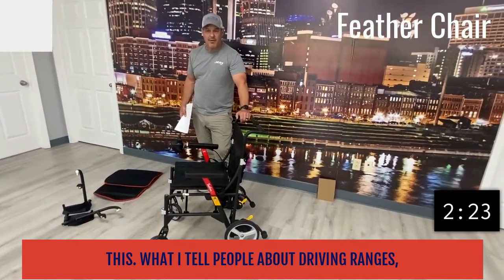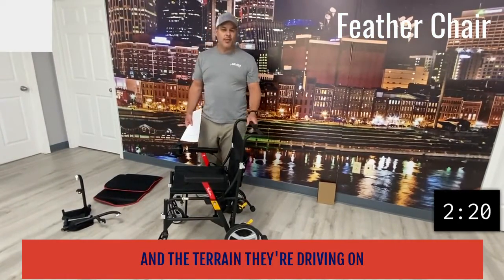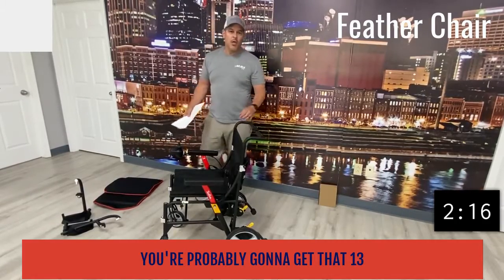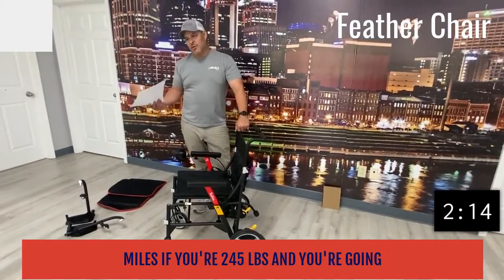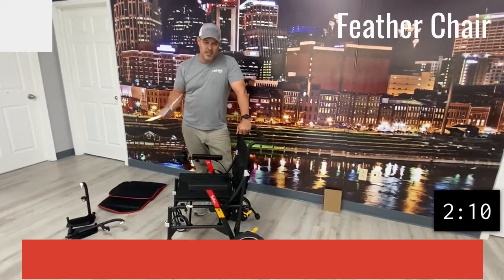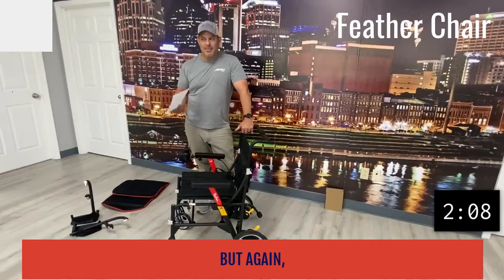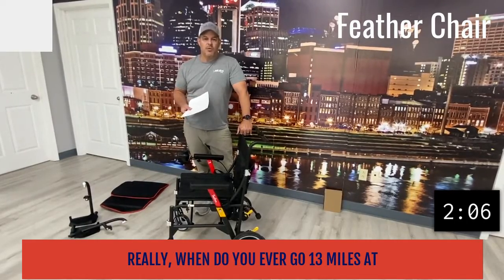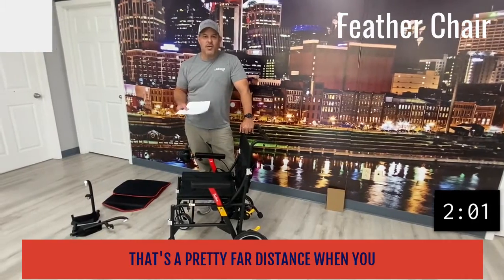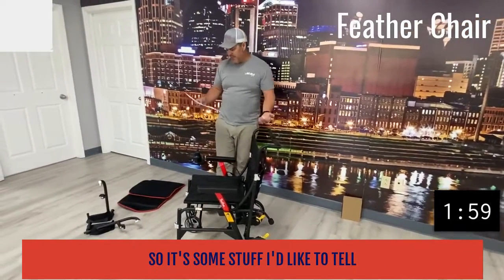What I tell people about driving range is it's all about the individual's weight and the terrain they're driving on. If you're on flat surfaces and you weigh 200 pounds, you're probably going to get that 13 miles. If you're 245 pounds and you're going up hills, you're probably not going to get 13 miles — just keep that in mind. But really, when do you ever go 13 miles at one time? That's a pretty far distance when you think about it.